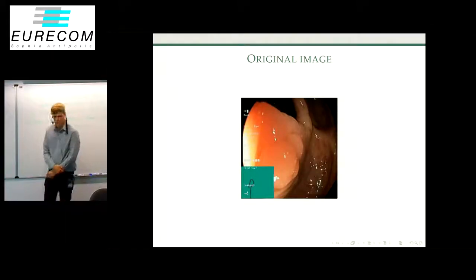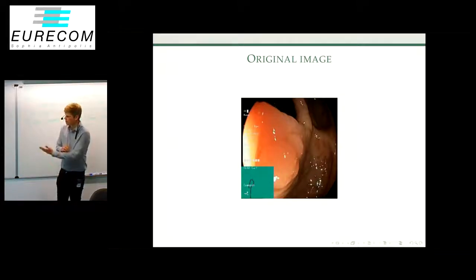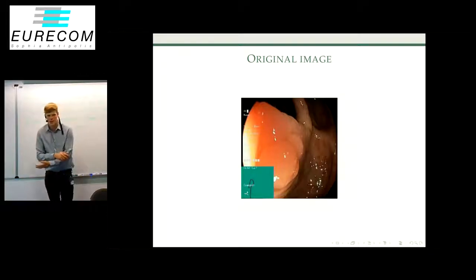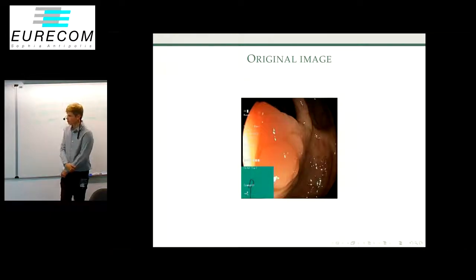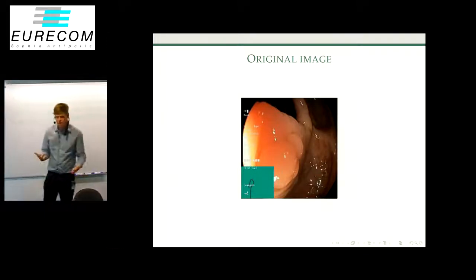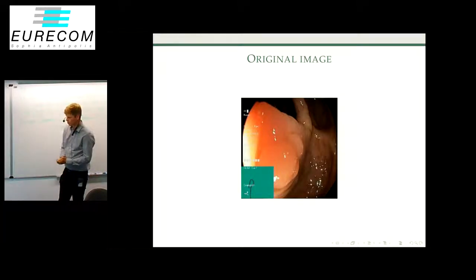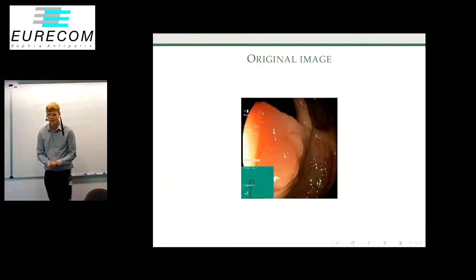We can see, as you've seen before in images, we have a green square in the bottom corner. We believe that this would have something to do with the classification, and it contains no valuable information for a neural network, since we're not interested in anything in this area. We're just wondering if there's a polyp or anything else that we need to classify. We went out and tried to remove those areas to see if that had any effect on the results.